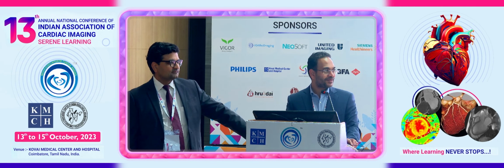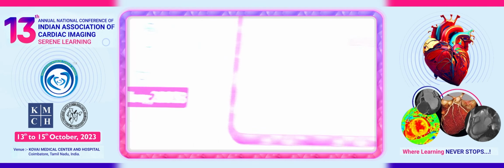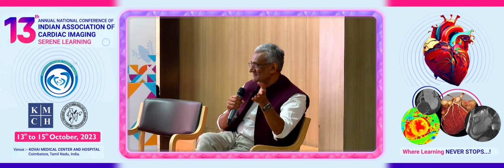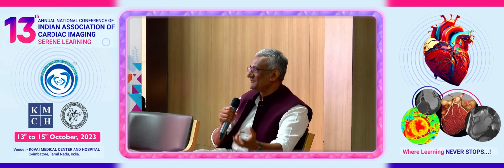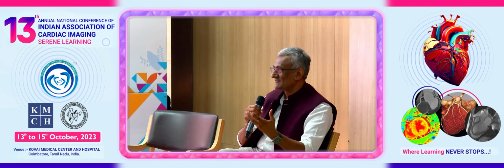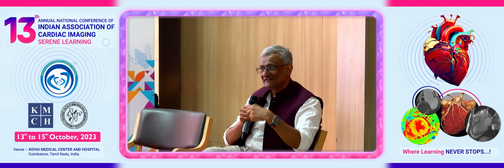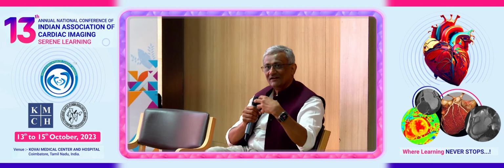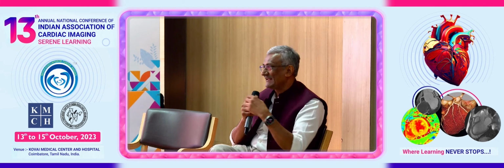Correct me if I'm wrong, just taking that argument on: if we're eyeballing mild, moderate, severe without measuring on CTs, then how does it matter whether it's 50 or 60 or 70 or whatever it is? The heart rate and the technique matter less, because just by eyeballing you're able to pretty much risk stratify people. Then what is the point of being so obsessive about technique? Your take on this?